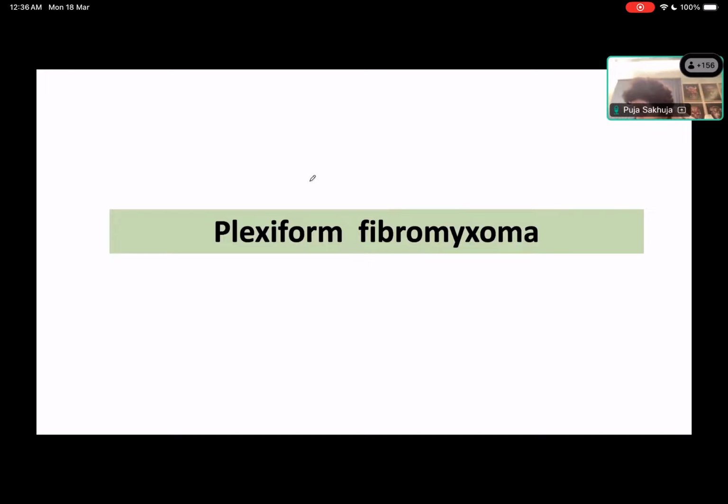Pragya? There's rare to low mitosis, correct? Yeah, these are not malignant tumors. Again, if there is a good excision, then the tumor may not recur or metastasize. But because of the plexiform nature, they sometimes do have a tendency for some part of the tumor to remain, and in that case, recurrence can occur.